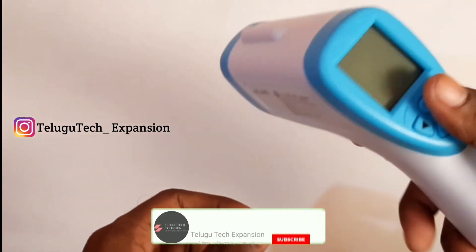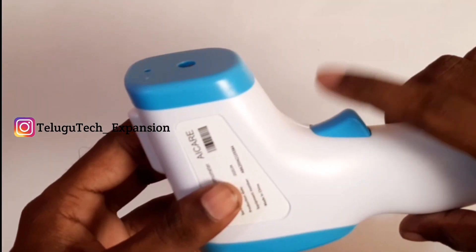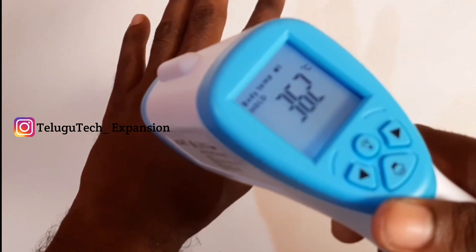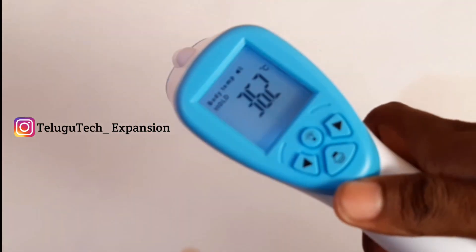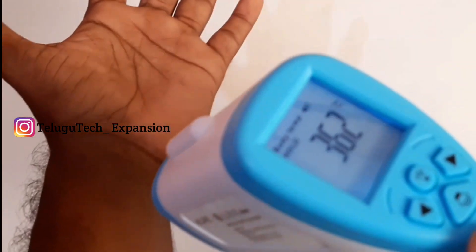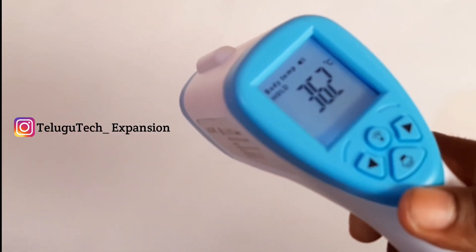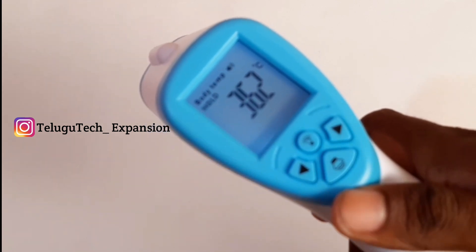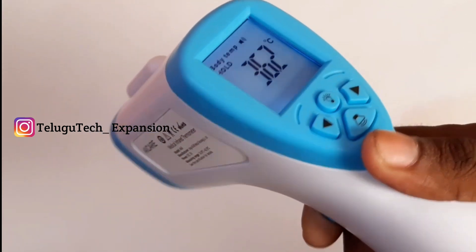I will show you the device. The battery will display. Use the device — in this manual it is pressure. I am going to show you guys. I am going to show you 36.2 — I am going to show you the body temperature when I measure the forehead. My body is 36.2 centigrade. It is 36.2 centigrade.